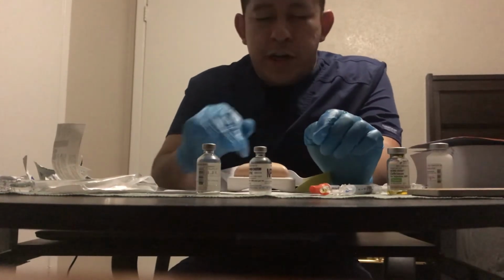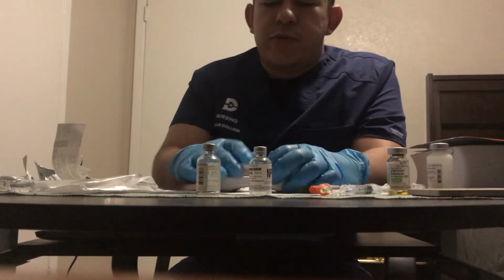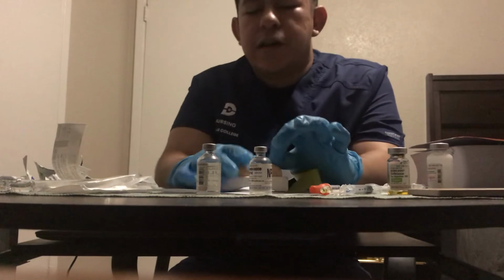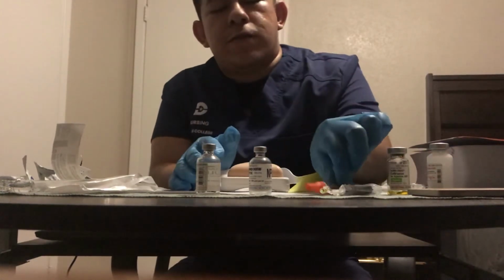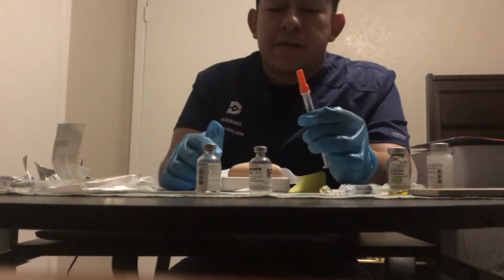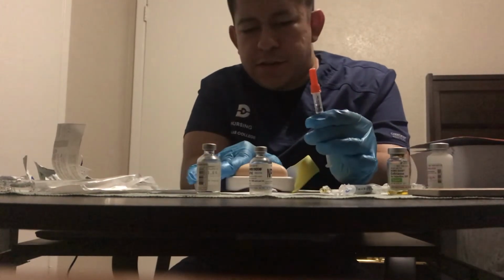So you wipe once the area is clean. Rule of thumb is if you cannot pinch an inch, you go in at a 45-degree angle. If you can pinch an inch of fat, you go in at a 90-degree angle. So we're just gonna assume for this case that Mr. Buzzard has a bit of meat on him, thankfully. So I'm going to pinch an inch successfully.